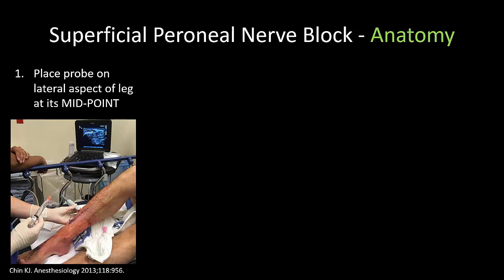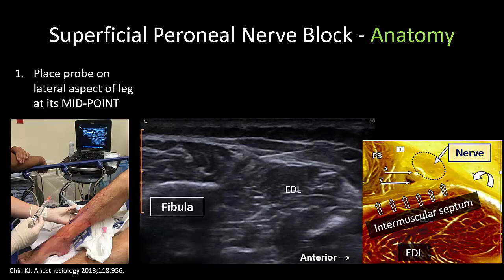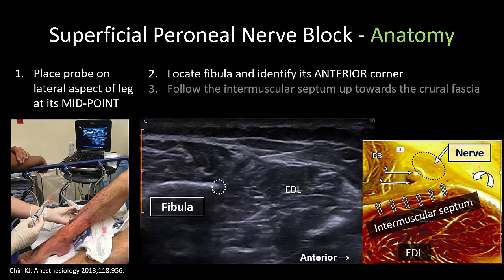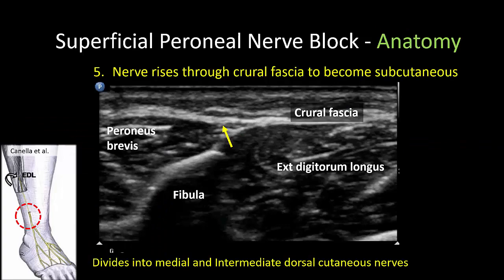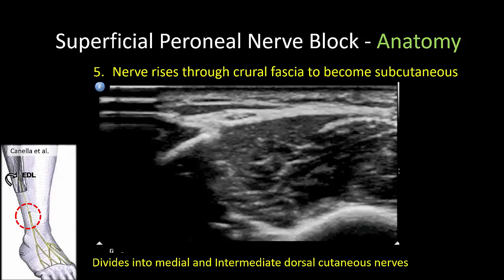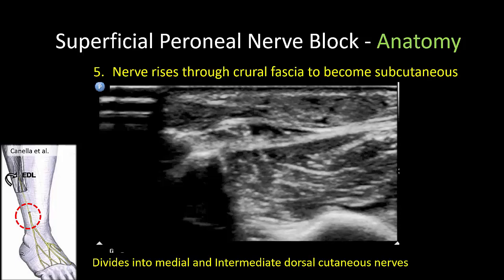Locating the superficial peroneal nerve on ultrasound is very simple. Start by placing the probe on the lateral aspect of the leg at its midpoint — it is very important to start this high up, as here is where the nerve will be consistently located below the investing crural fascia. The fibula is easily visualized. Identify its anterior corner and then follow the septum that divides the lateral compartment from the anterior compartment all the way up to the crural fascia. The nerve will be contained within the triangular compartment that lies just deep to this fascia. Its identity is further confirmed by tracing it distally and seeing it rise to pierce the crural fascia, where it lies in a subcutaneous location and subsequently divides and branches. Injection of local anesthetic will then outline the nerve clearly.